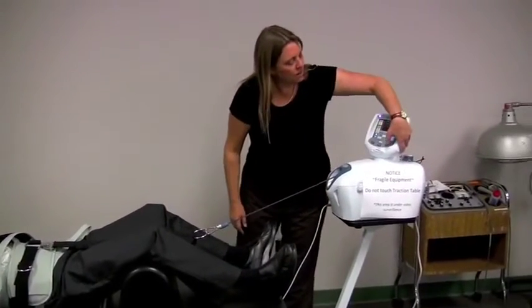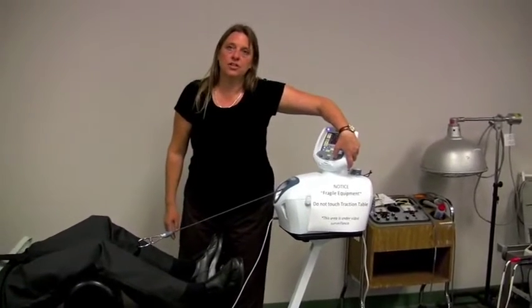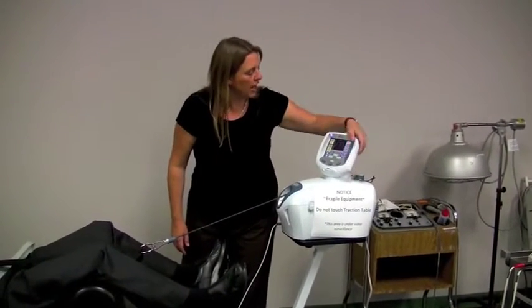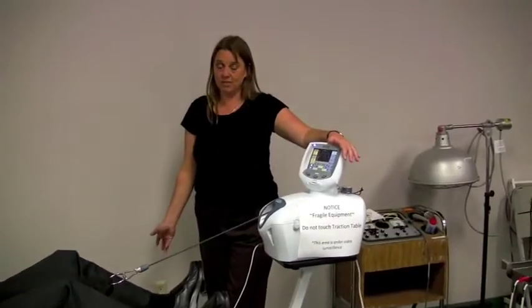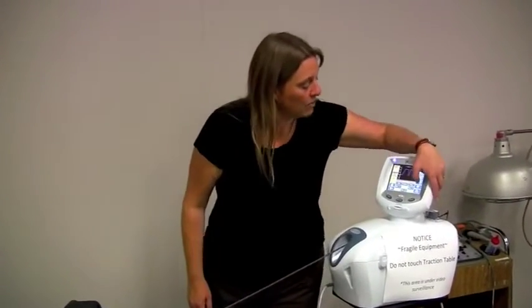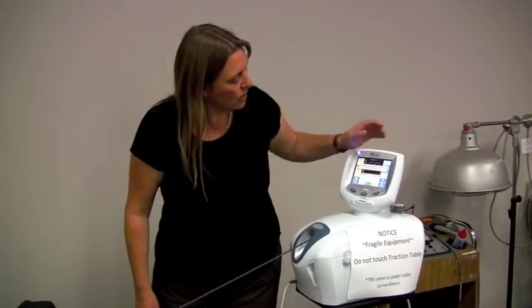Next, we're going to hit start, confirm everything, 1-minute progression, 2-minute treatment, 1-minute regression, starting at his pounds of 43 max. We're going to start at 43. Now how I chose that is it should be 25% of the body weight, and so we had already pre-calculated that amount. Okay, let's see, let's go ahead and hit start.